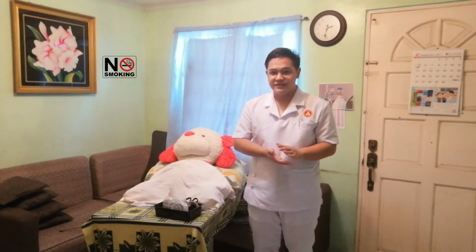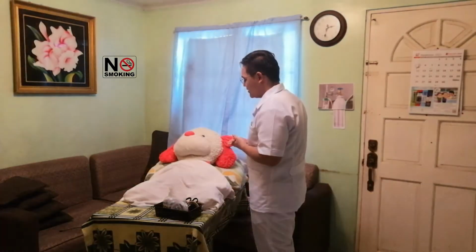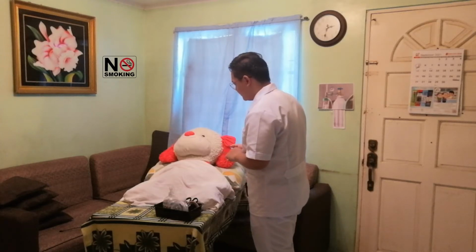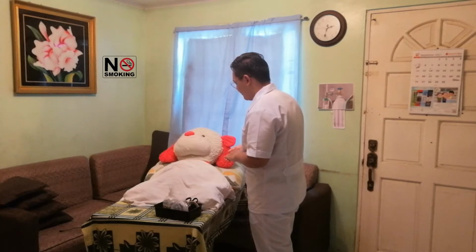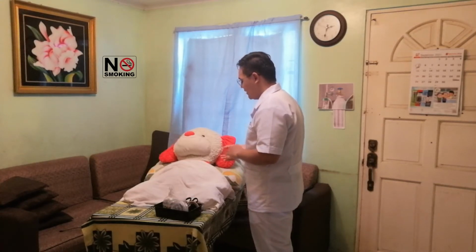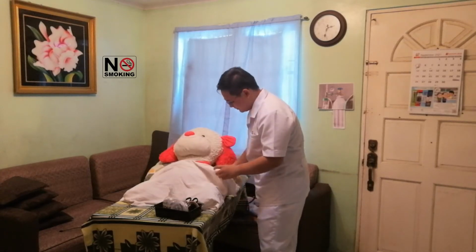So first thing that we need to do is introduce ourselves to our patient and verify the patient's identity. Okay, so good day po ma'am, my name is Christina Lamsmang as I have said earlier. So for today po, I will be your student nurse. Is that okay po? Okay, so may I know your name po ma'am? Okay, how about your birthday po? Okay, so may I see your wristband po? Okay, thank you po.